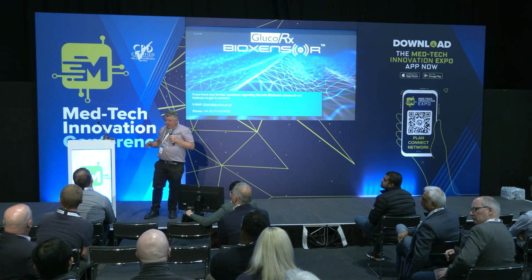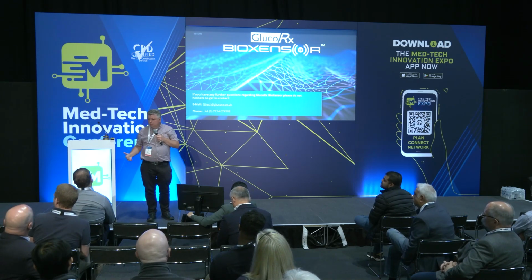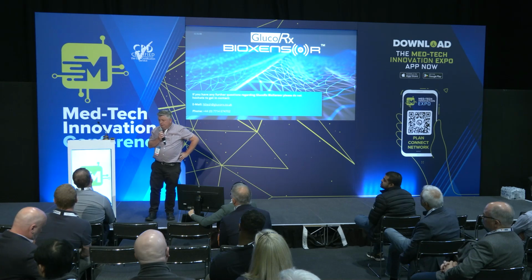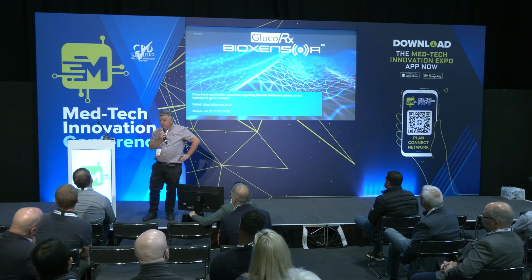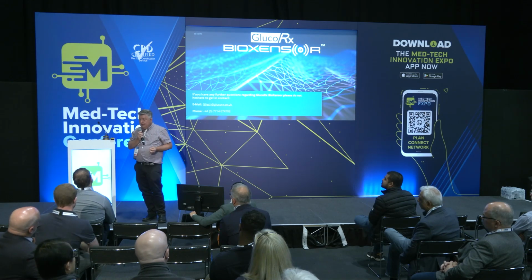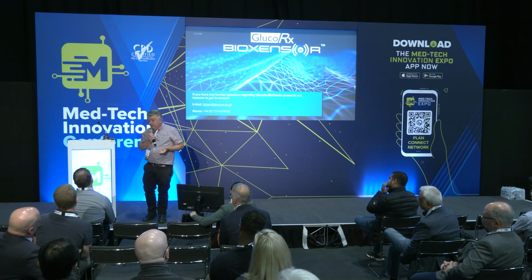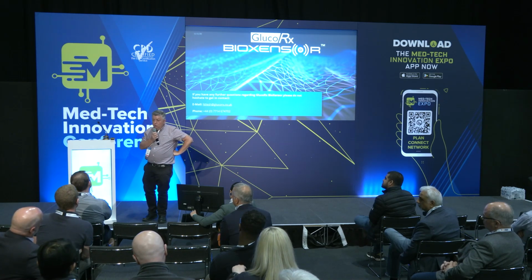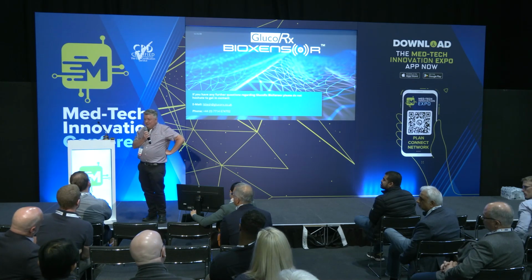The only thing we can do there is to compare our results with known blood glucose values. So what we do is through the clinical studies, which are obviously MHRA approved. Within the study protocol, we take blood every, say, 10 minutes after the OGTT, or glucose tolerance test. All we can lean on, really, is the results that we get from that blood glucose analyzer measurement. So we take 3 measurements of venous blood, so we're not just doing it based on one measurement, and then we do our statistics based on that. And then we're correlating our sensor with that of the gold standard. But apart from that, we haven't got any other way of measuring it. So we are a bit of a slave to that.